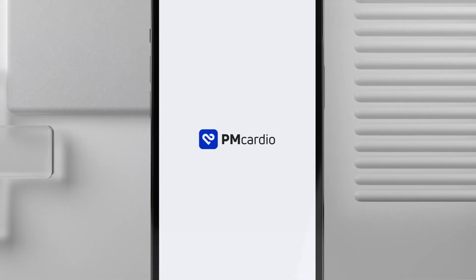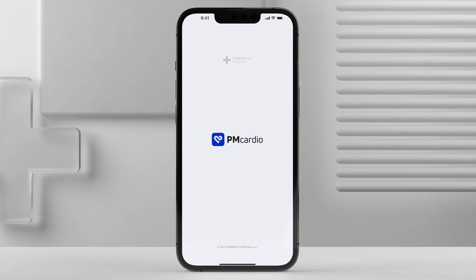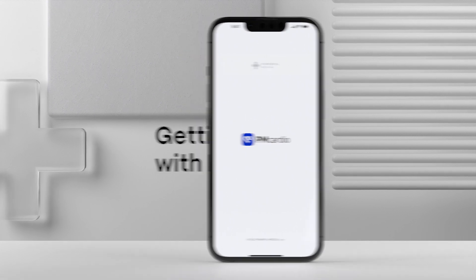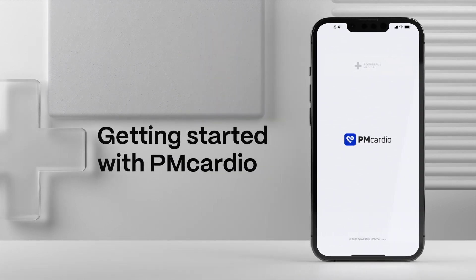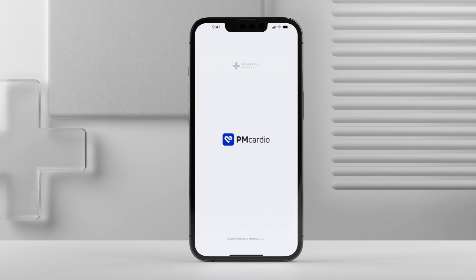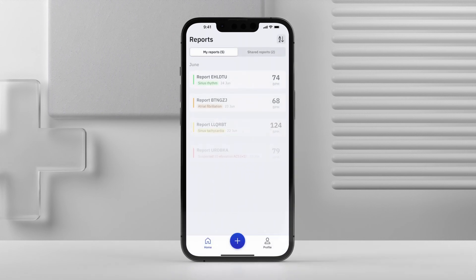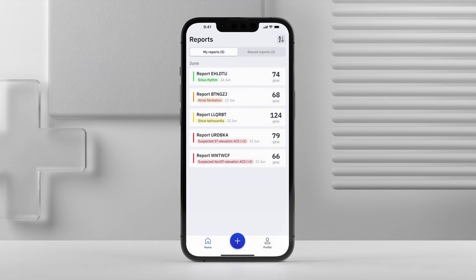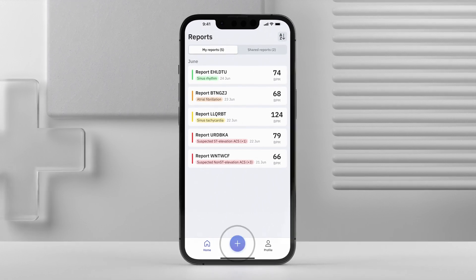PM Cardio is an AI-powered medical solution that enables you to read any ECG and accurately diagnose and treat cardiovascular diseases. Here's how to use it. To create a new report, simply press the plus button at the bottom of the screen.